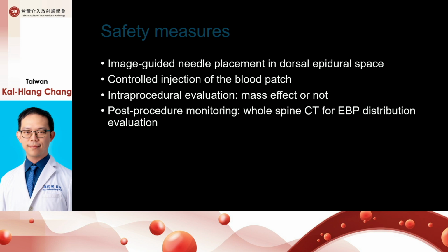Now let's talk about safety. Safety is an important issue in any kind of intervention, and cervical epidural blood patch makes no exception. With a controlled injection of blood patch and a careful intra-procedural evaluation, we can evaluate the patching distribution. Is there any mass effect compressing the cervical cord? And in post-procedural monitoring, I personally routinely perform a whole spine CT for a final distribution evaluation and to predict the outcome.